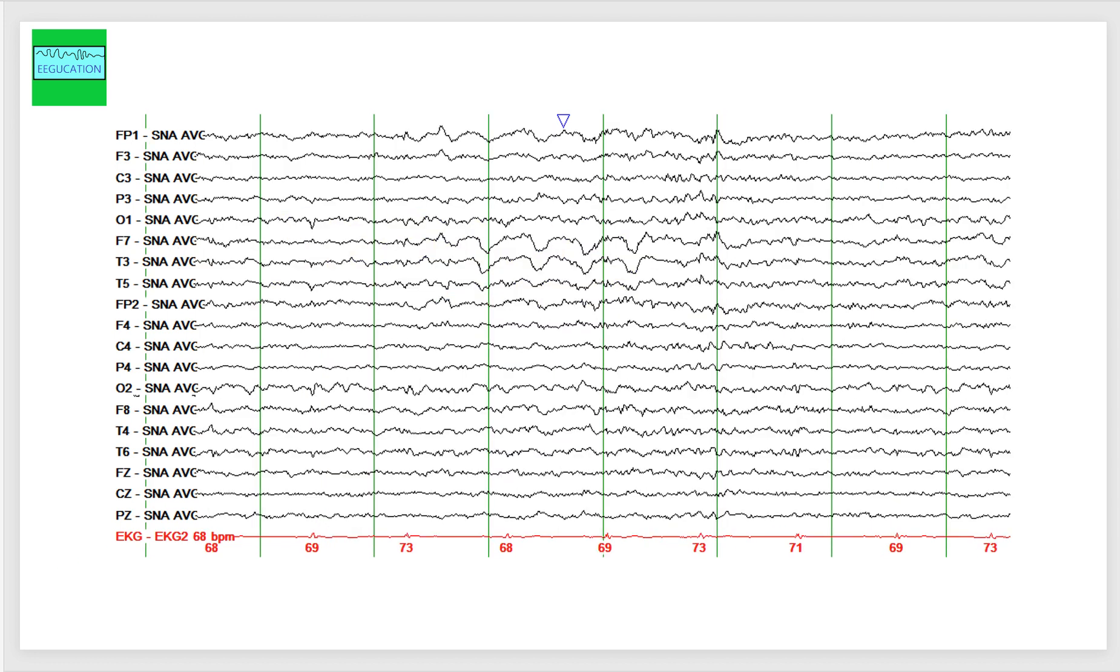This is the same patient. We do not see the sharp waves on this page, but we see the delta activity, which is pronounced in F7, T3, FP1, and also extends to F3.